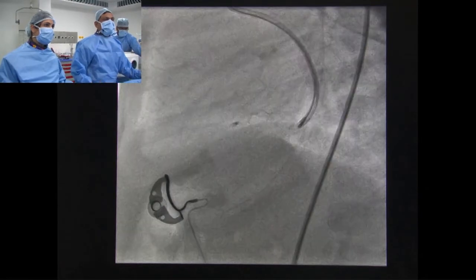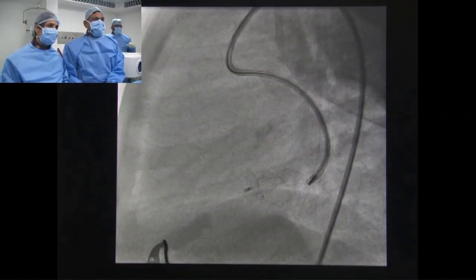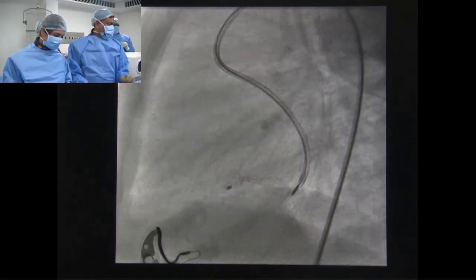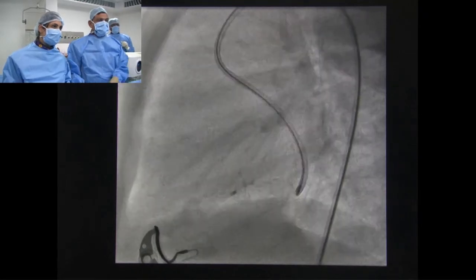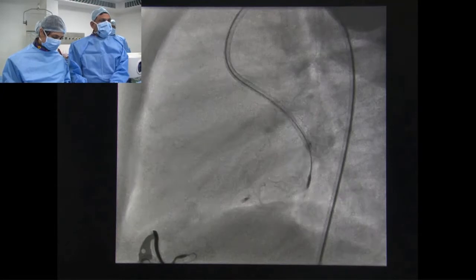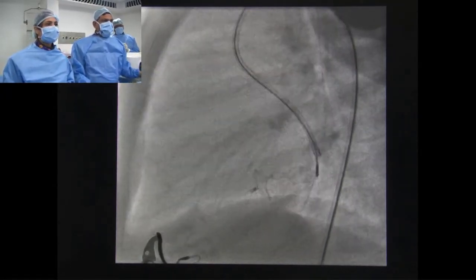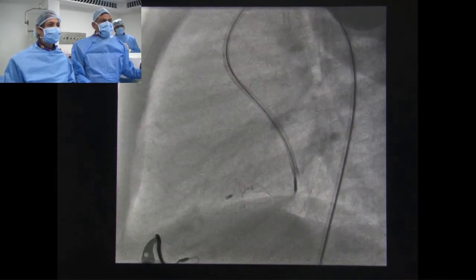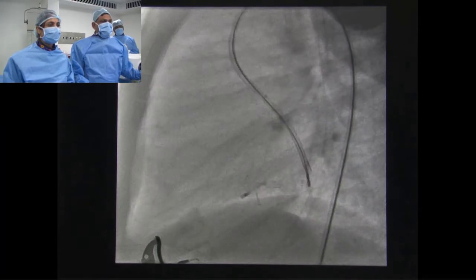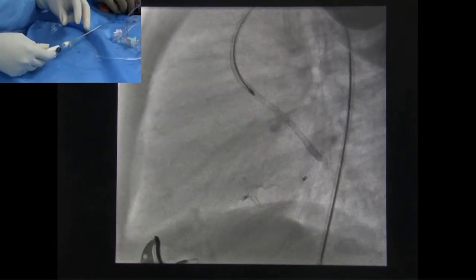To adjust the table. Okay, just wait. Yeah, please deploy. It's going to take a little longer because there are quite a few twists and turns in your catheter. So it will not be easy to unscrew it. Yeah. You have to pull it a little bit. Yes.